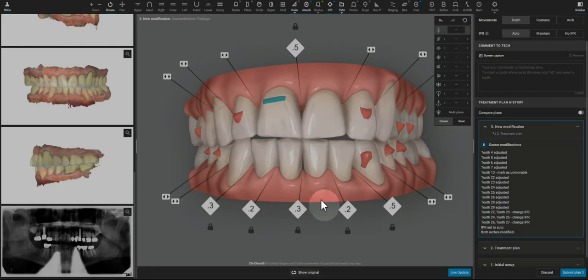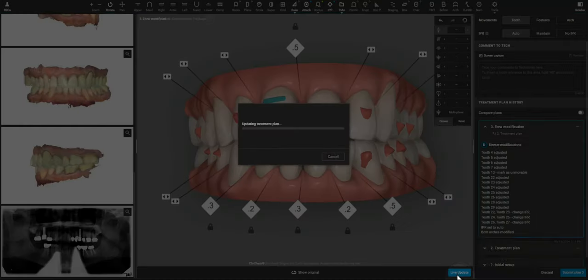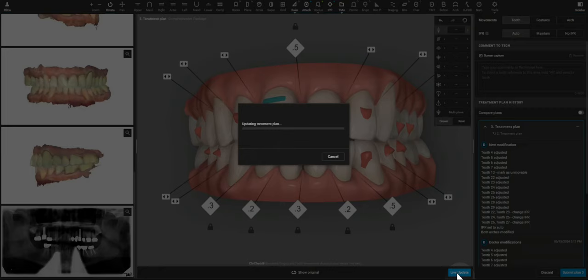So from here, I can fortunately use the live update tool and then we'll have a ClinCheck that is ready to approve. I'll pause the video and then we'll look over it again.